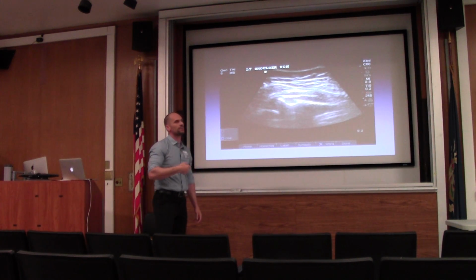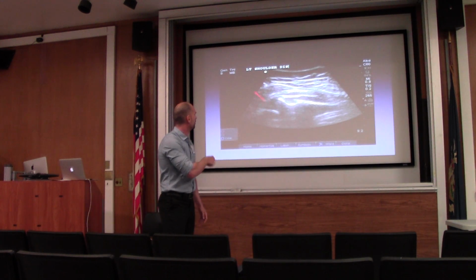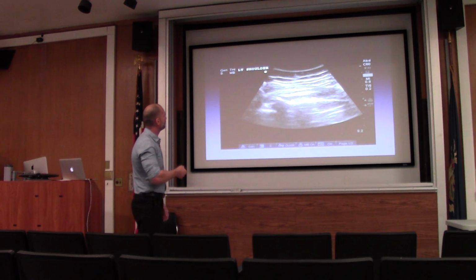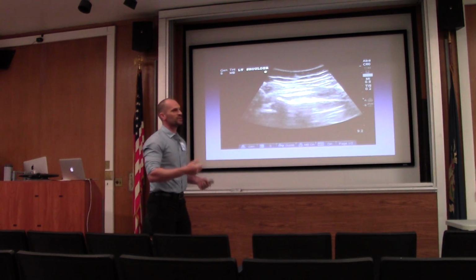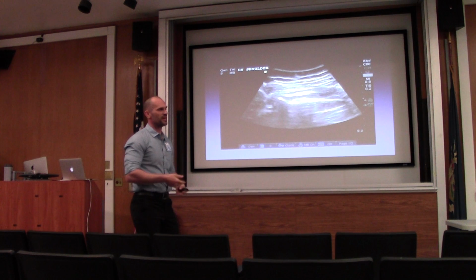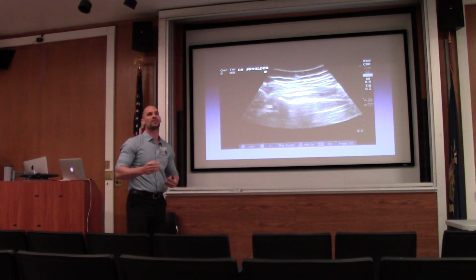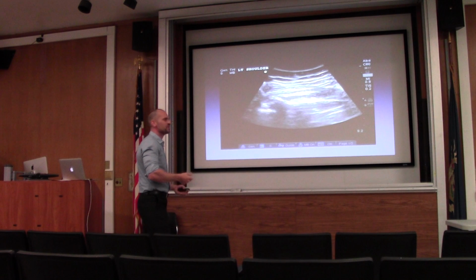When we end up doing these intra-articular lidocaine blocks, this is pretty much how we're aiming. Injecting into the actual joint, sticking the needle into the space, is really not the hard part. I know you guys know how to do that. You've done ultrasound-guided peripherals, you've done ultrasound-guided centrals. Basically, sticking a needle in the place where you need to go, I don't feel is the actual caveat. That's not the mastery of this drill.